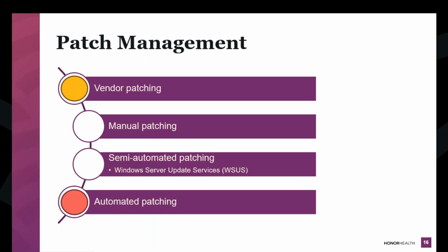Okay, we're looking at orange here, right? At least it's patched. Make sure you get that documentation. Very expensive, usually, and they do it whenever they feel like it. So those two things are kind of a downside for vendor patching. And make sure you have that documentation, right? So it can be audited.